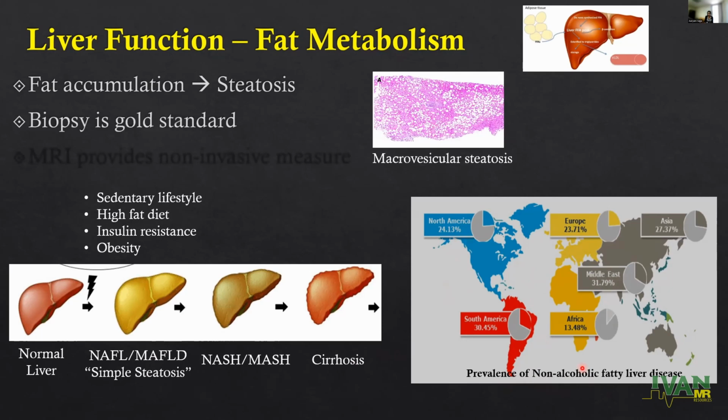And again, biopsy is the gold standard. You see here, these are the histology images, and these white circles are showing the fat deposits. And again, we don't want to do biopsy. So MRI has emerged over the last two decades to measure fat, which I'll explain in a second.